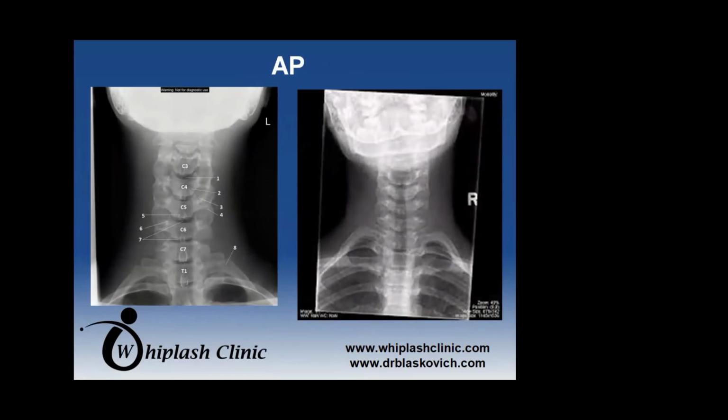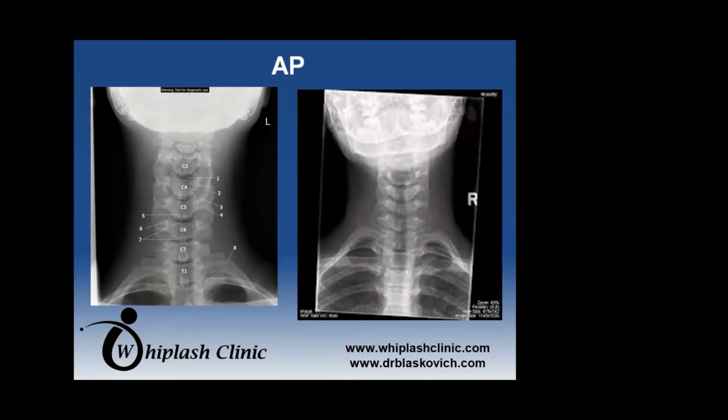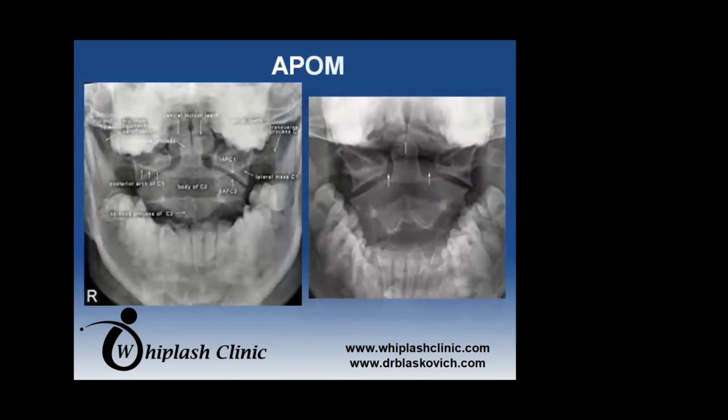Do you think it's kind of curious to know that this kind of stuff doesn't make its way into reports when I read reports? Really? Seems pretty logical as far as I'm concerned. Mhm. And then we'll get on to the APOM. So on the left side, you've already seen the normal, and can you tell me what would be unusual or not so normal on the right-hand picture?